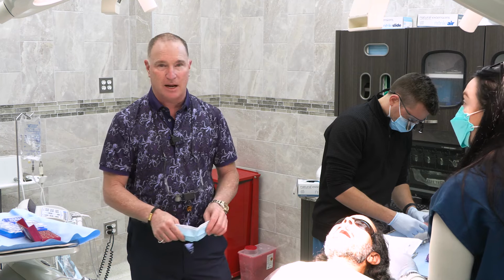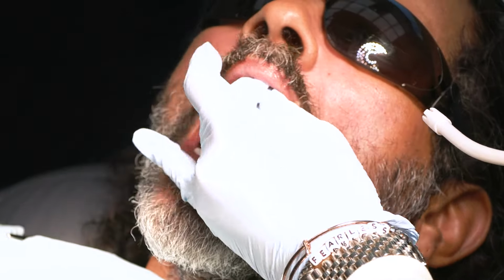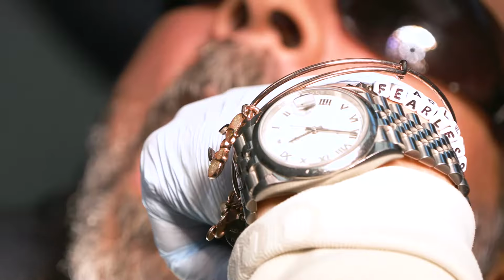So we are going to place 10 implants on top. We're going to use 8 11 by 2.5s and 2 10 by 2.5 Shatkin F.I.R.S.T. mini implants. We'll get started. We're going to use short implants because he's got a low-hanging sinus, so 2.5 11s and 2.5 10s. So we'll use 8 11s and probably 2 10s.